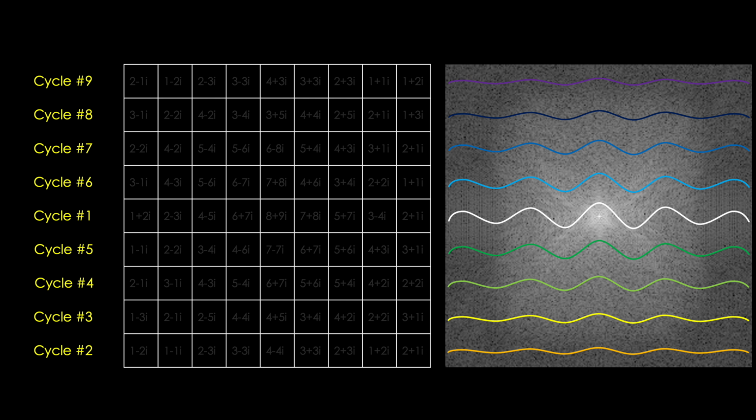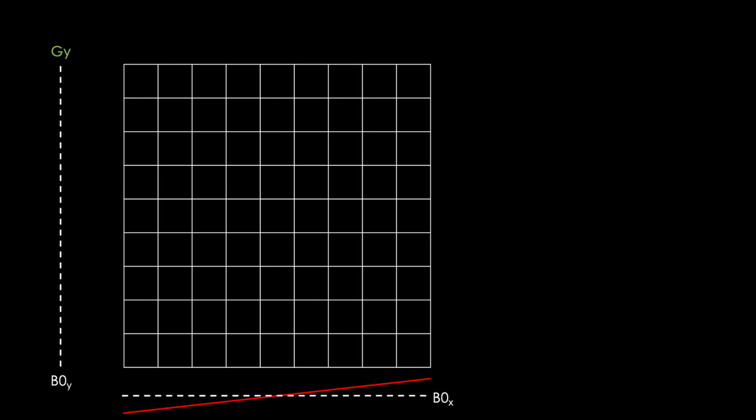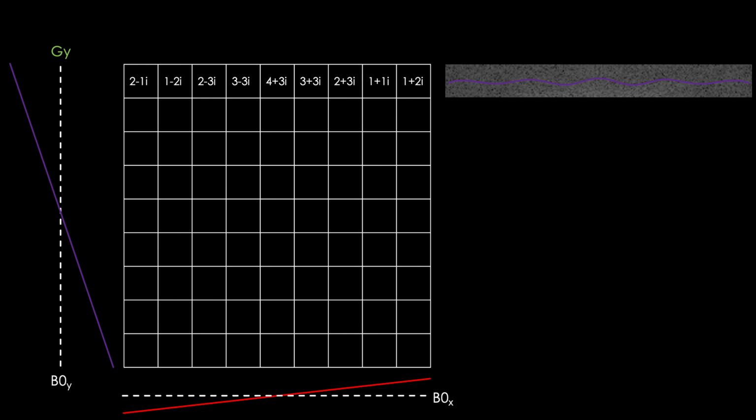Remember that this is just an empty placeholder we record our data into line by line, starting from the top and continuing downward, so from a picture building standpoint, we can apply whatever gradients we want in whatever order we want. Our goal is not to make the picture on the right appear in a certain orientation. It's only to capture enough frequencies through our Kx and Ky variables to generate an understandable MRI image. That being said, there is a somewhat standardized way to go about applying these gradients in a traditional spin echo sequence, starting from the top with the maximum GY gradient and proceeding as shown.